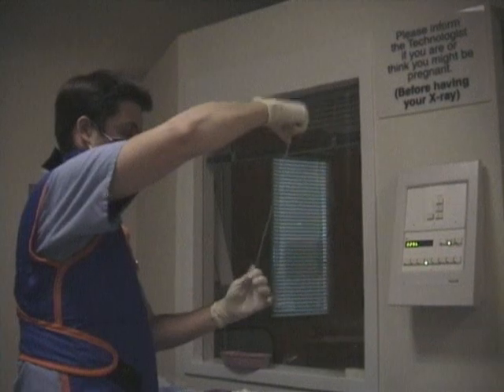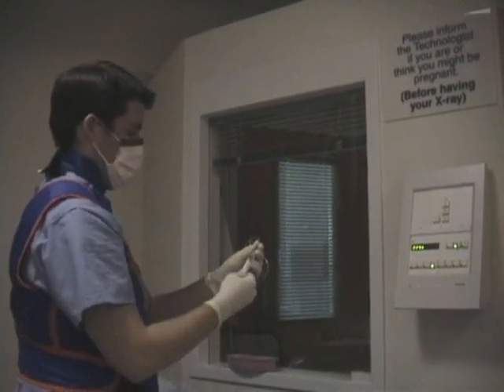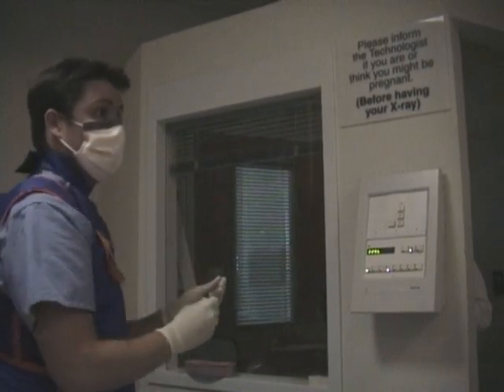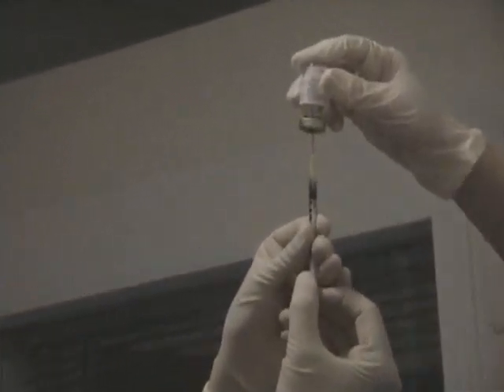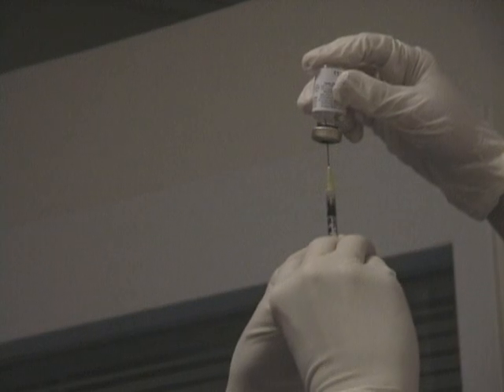Straighten out the tubing and then connect the Conray syringe to the tubing. For the Magnivist, use the 1 cc tuberculin syringe. Draw back about 0.1 cc's of Magnivist, and make sure you evacuate any air bubbles.